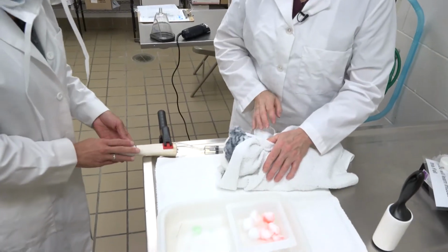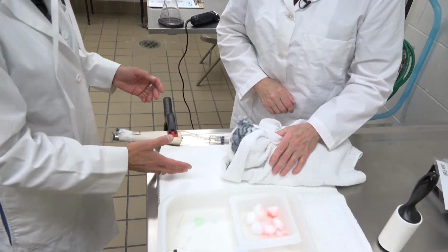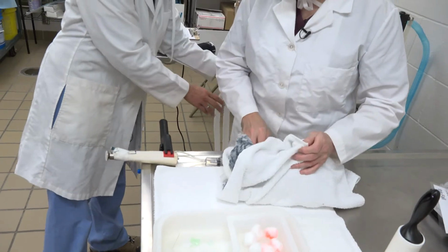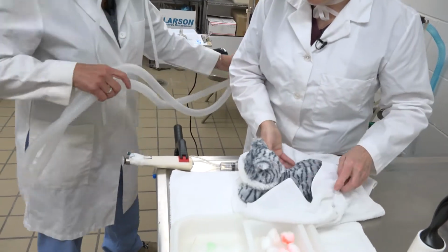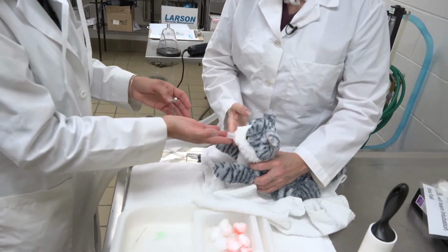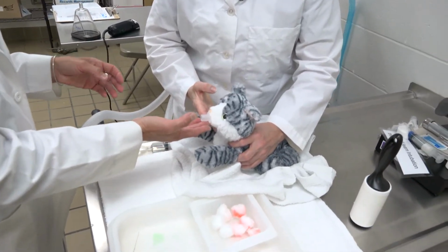All right, so our catheter is in. Our patient's doing well. We're going to pre-oxygenate, we're going to intubate rather. And you guys haven't had that yet, so our kitty for our dry run is already intubated.